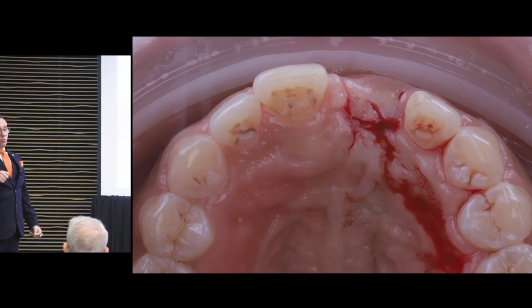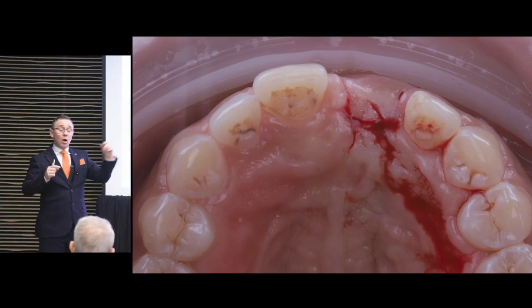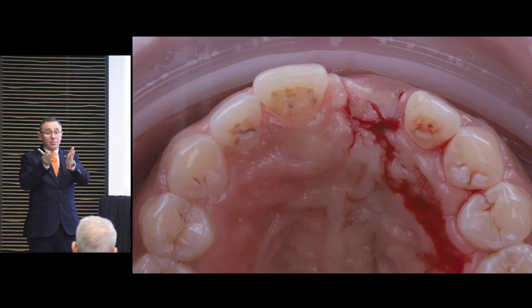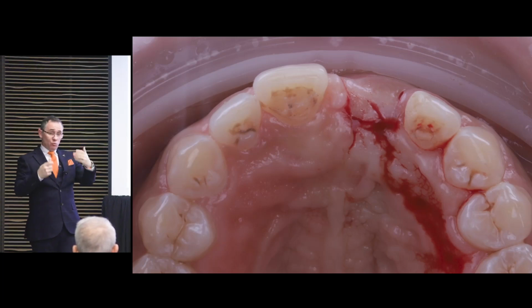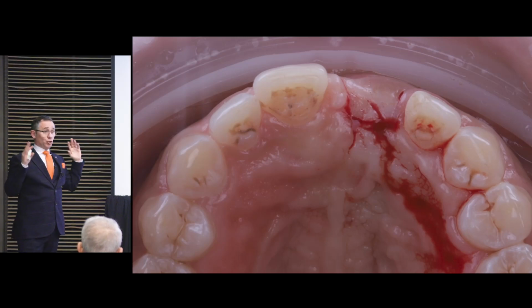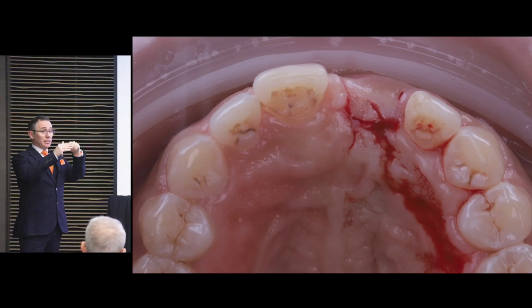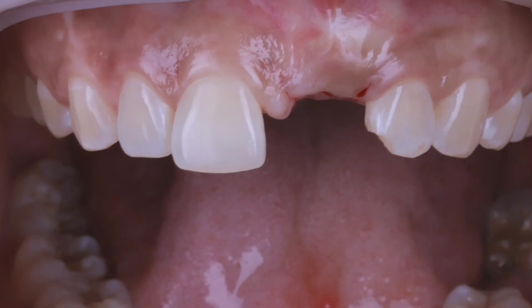It's the same sort of thing. I mean, we know you're not going to get the same sort of attachment, especially because we're using the acrylics. That's why we're now saying, look, use the 3 or the 4. So all of it's titanium, and really just be 1 millimeter below the tissue with your crown. So we're utilizing the depth more. We weren't before. I was just too cautious, but now I've got the confidence. If you see more of our recent cases, you're seeing them literally 1 mil below, and then the crown's developing. So back to you, Martin, for placing it.